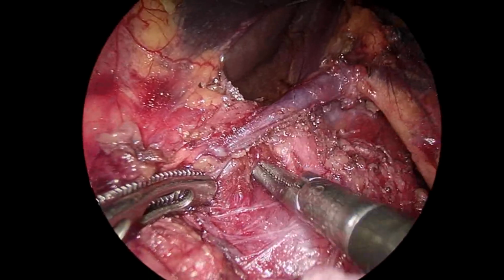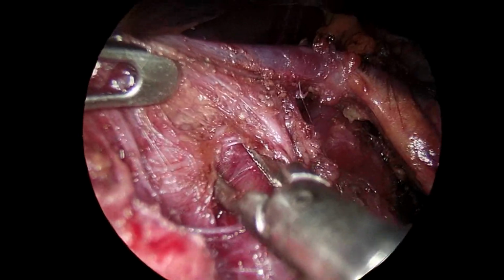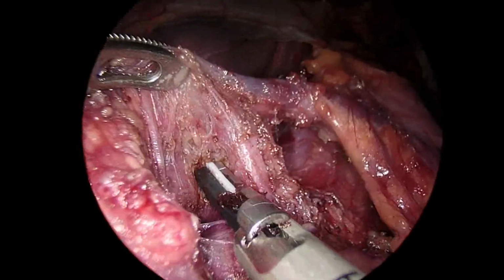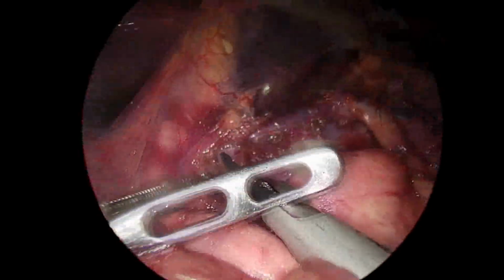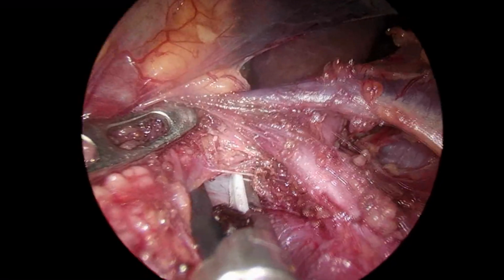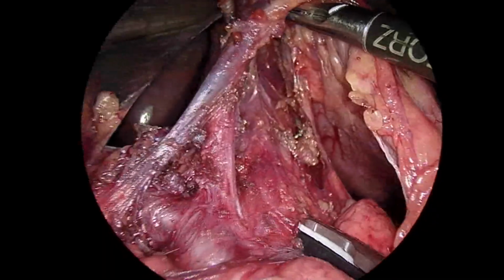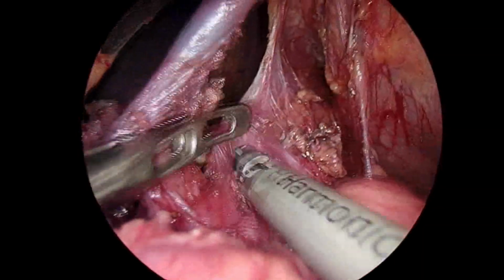So creating the plane and then dissecting the tissue. There will be one step where one feels the give way, the taut structure which was compressing the aorta and the celiac trunk. At this stage, we are still dissecting above the aorta, and now this is the tough structure which is being dissected.